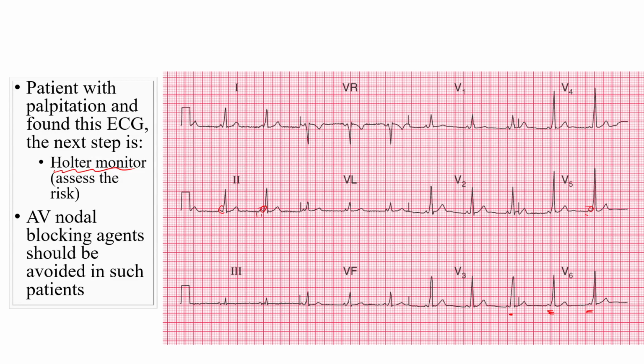Intermittent appearance of this delta wave carries a very good prognosis, while the presence of atrial fibrillation runs carries a worse prognosis for the risk of developing wide complex antidromic tachycardia. How should we treat them?